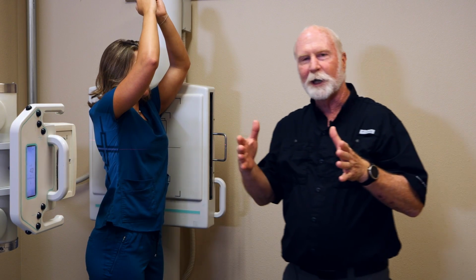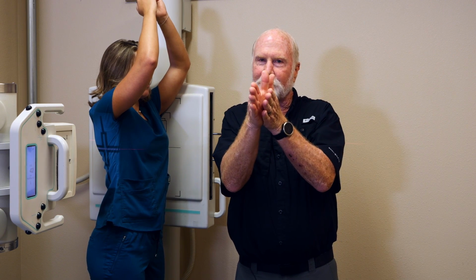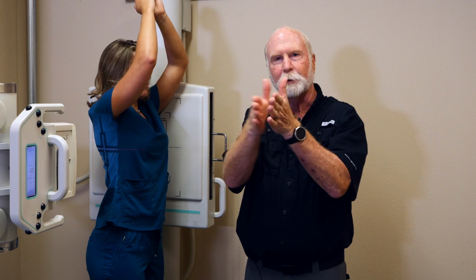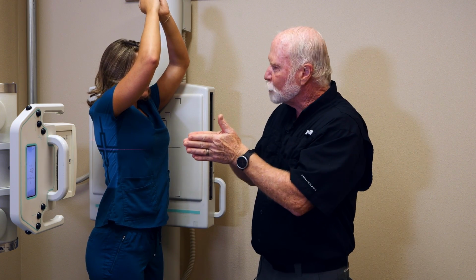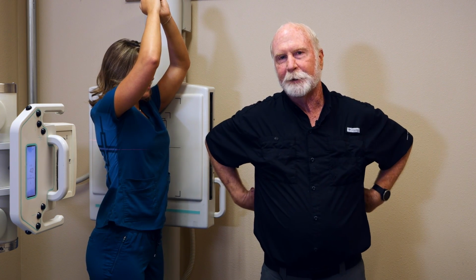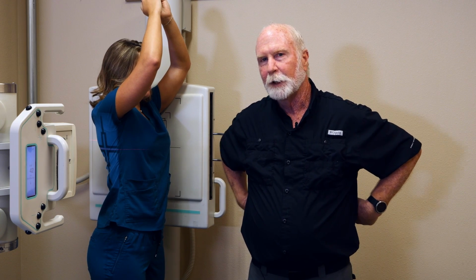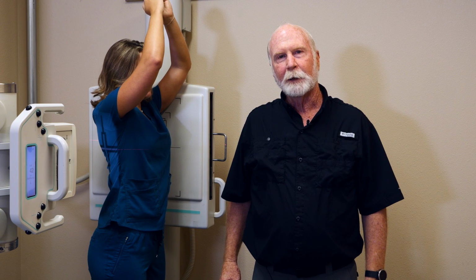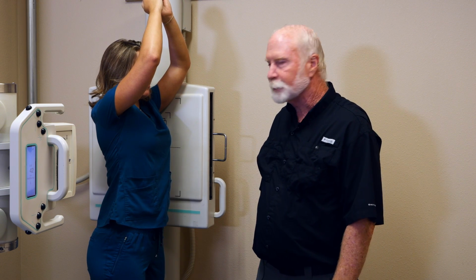Now, remember for a chest x-ray, we're going to tilt that patient a few more degrees to make the illusion that we have a nice lateral, to get those posterior ribs to line up, because we're not centering the chest, we're centering back posterior of the chest. We don't need to do that in this view. So same thing, we want it nice and still, nice big breath, make the exposure, and there's a lateral T-spine.